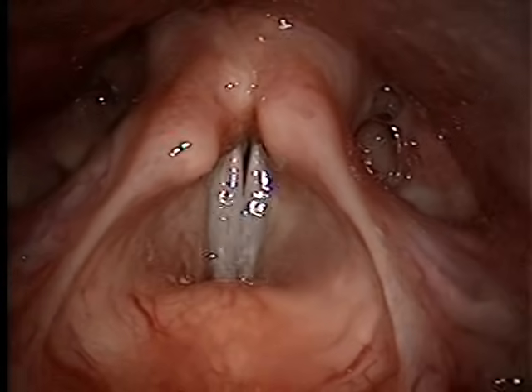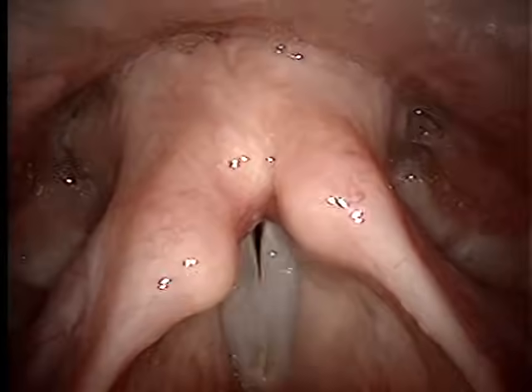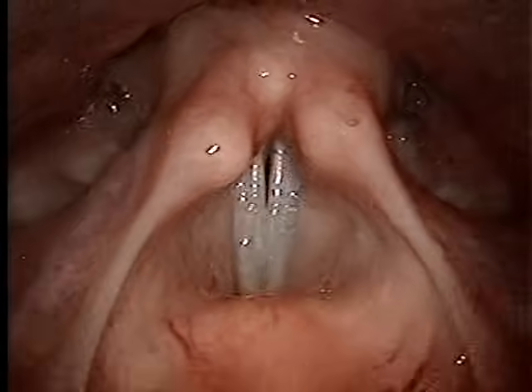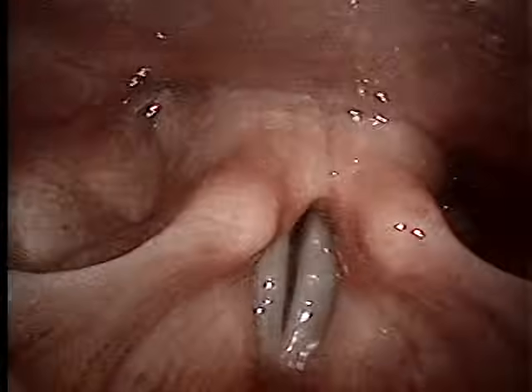You can watch the vibration a little bit better. Yeah, that's really neat. So that's where you can count the open, close.